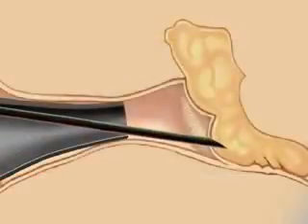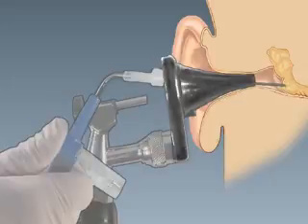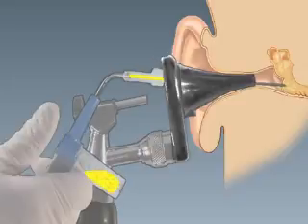This video provides only an introduction to tympanocentesis. Further training with an otolaryngologist is necessary. Tympanocentesis is an underused procedure. Clinicians should become familiar with tympanocentesis so that they can safely perform the procedure in children with acute otitis media.